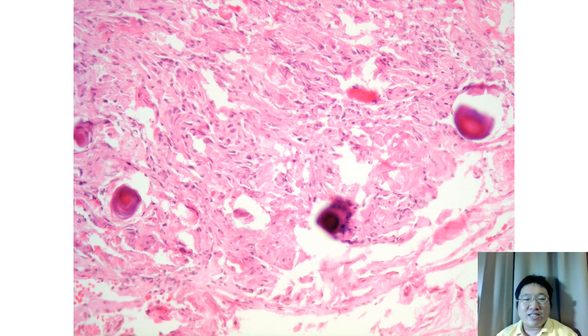And the second one is meningioma. Yes, meningioma. In meningioma, psammoma bodies can also be detected. And the third one, which I think is optional because it may be difficult, is serous carcinoma of the ovary. These three types of tumors are the main ones that have psammoma bodies. In meningioma, we have psammoma bodies, we have syncytial growth, we have a whorling pattern. That is meningioma.